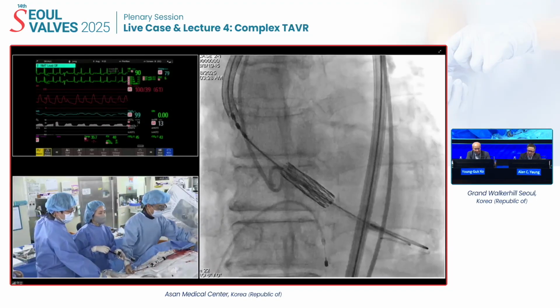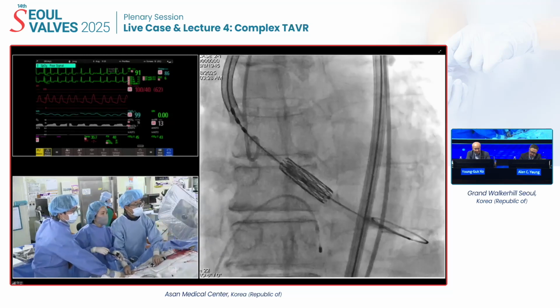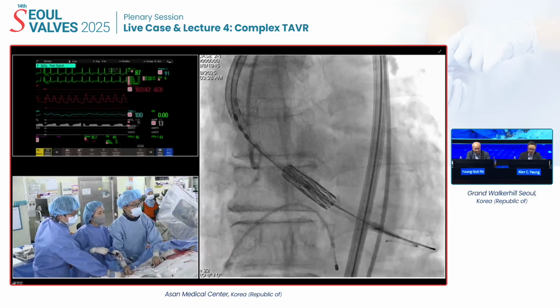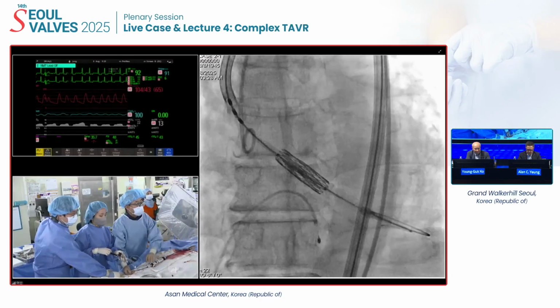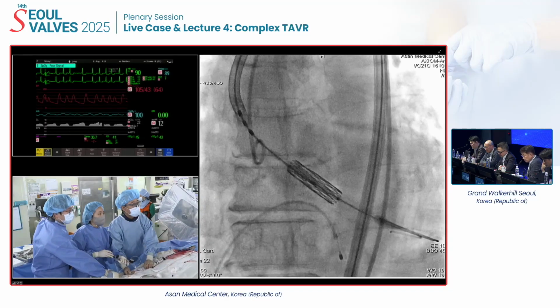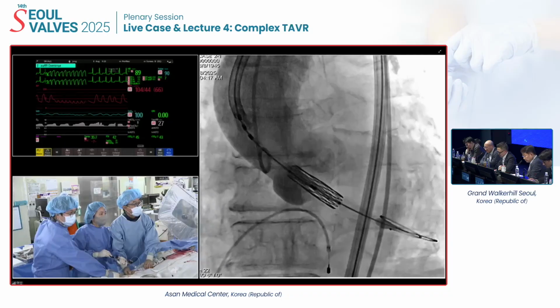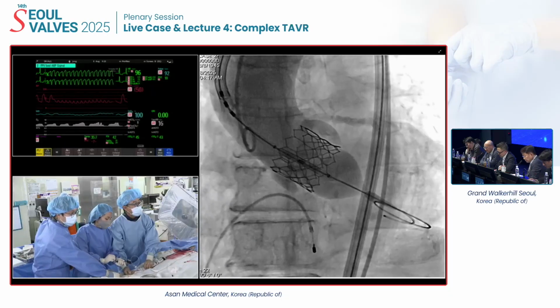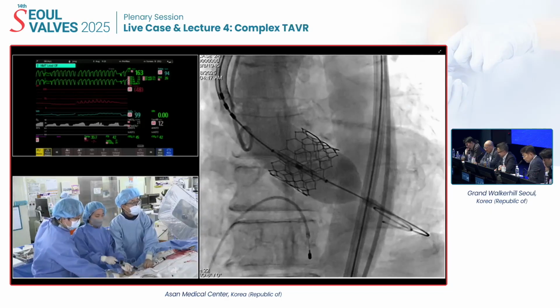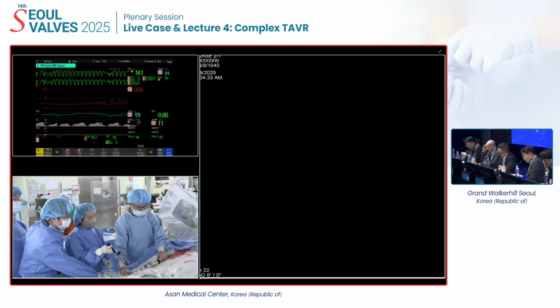Okay. Elbow. Okay, I think the position is good. Okay, test. Perfect. A little more. One more test. Okay, ready? Okay, I'll go slowly. Pacing on, contrast. Okay, inflate fully. 1, 2, 3, 4, 5. Deflate. Wait. Pacing off. Okay.